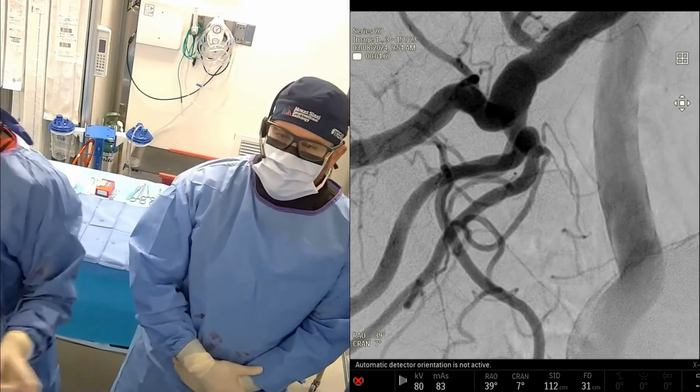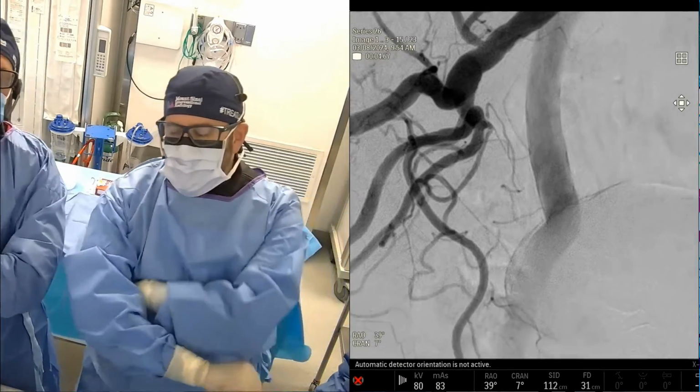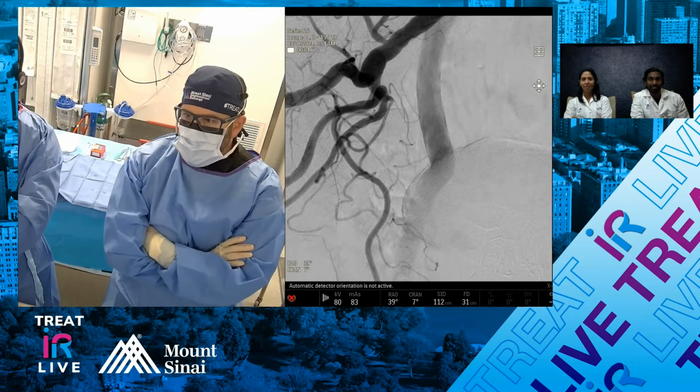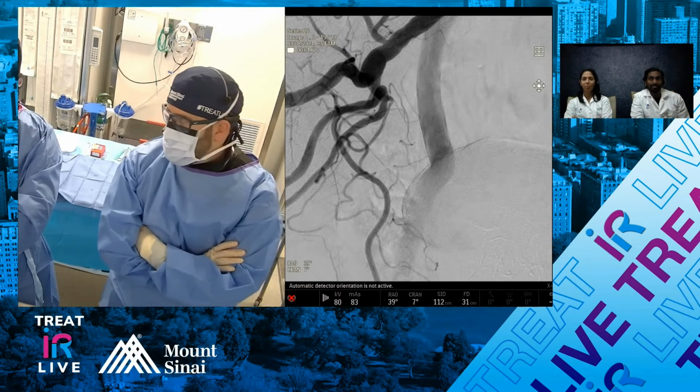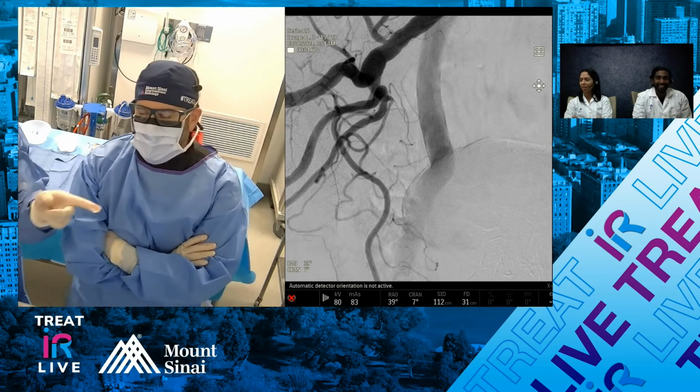So we actually looked at this, and we're going to present this. Type 1 is most common. Well, no, they're about equal. It depends on what you look at. A 4 is probably the most common. I'm in Dan's camp. Can we roadmap that?